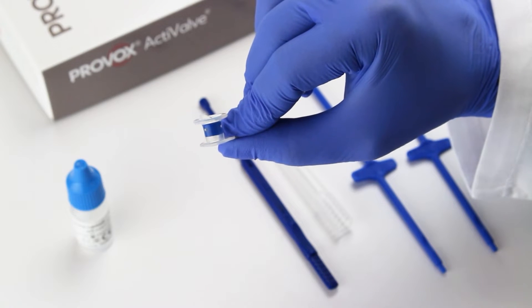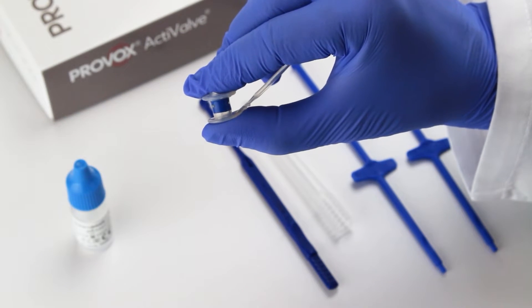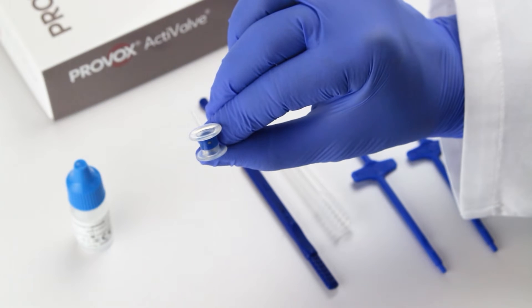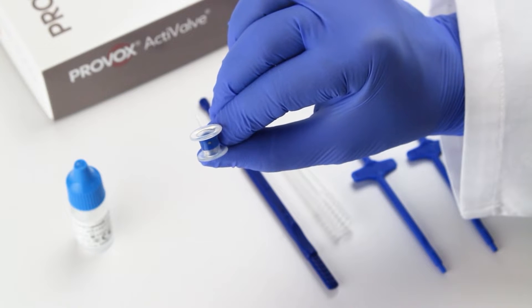The device is made of a medical grade silicone rubber and radio opaque fluoroplastic. The valve and valve seat, or ring, are both made of blue fluoroplastic in order to prevent the buildup of biofilm, which is the most common cause of early leakage.